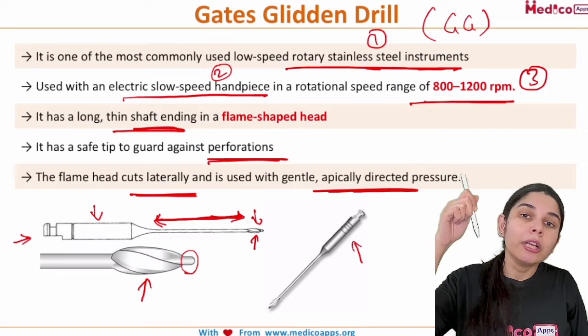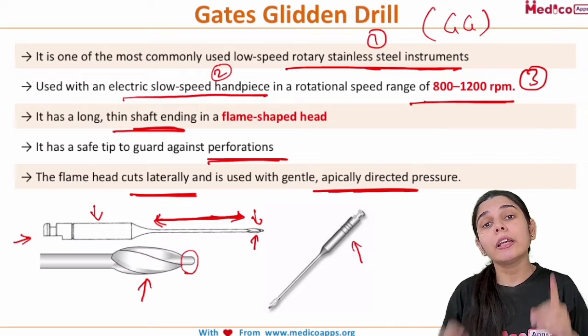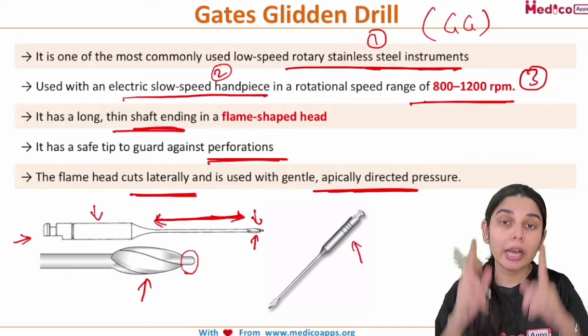Okay. Now, I also want to specify one point: the GG drill is specifically used when the root canal is straight.